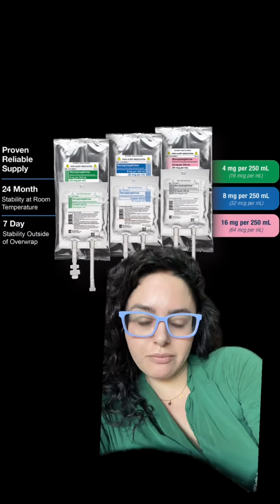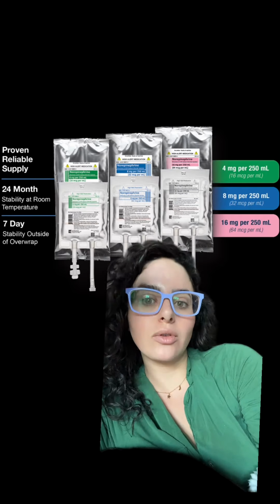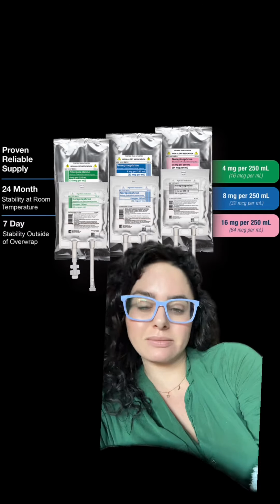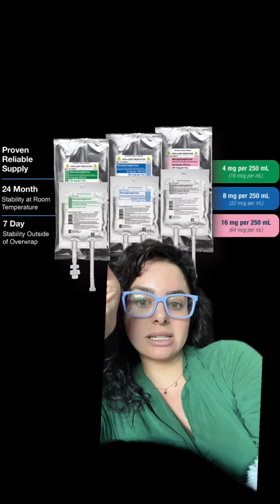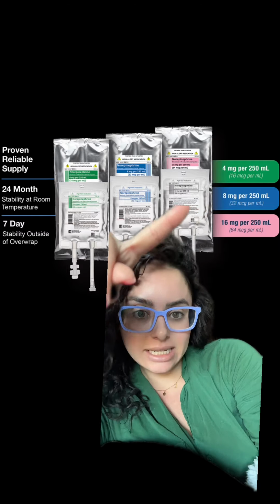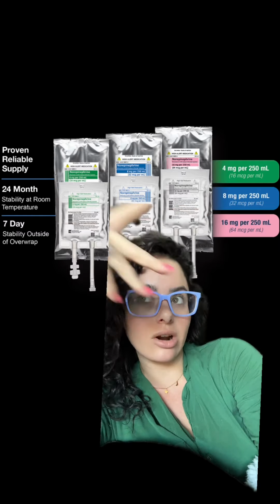A lot of the drips that we give patients, especially the vasopressors, have different concentrations. So for example, here, these are 3 different concentrations of Levophed. Levophed is a vasopressor that we use. It's typically kind of our first line in most situations. But the green bag, this is a 4 milligram in 250 bag. Your blue is an 8 milligram in 250 bag, and then your pink one is 16 milligrams in 250. And at my hospital, we even have a 32 milligram in 250 that our pharmacy makes up.